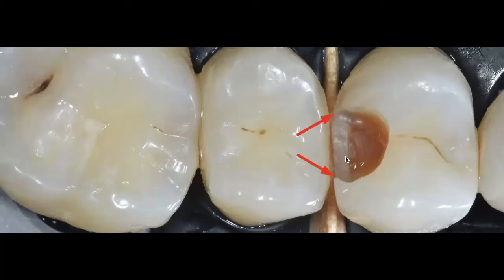So the only way that you're going to be able to bevel these walls that I'm showing you here with the arrow is by having good access, by creating that separation. If you don't do that, your burr is going to nick the neighboring tooth for sure.